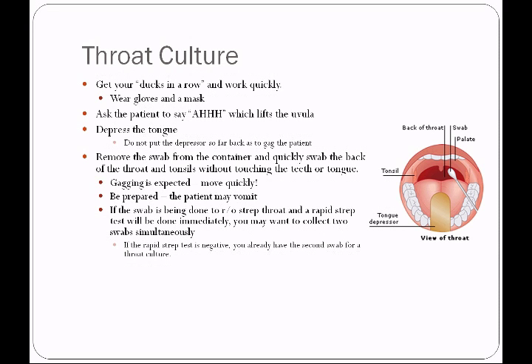That's beneficial because if the rapid strep test is negative, oftentimes the doctor will want the specimen sent to the hospital laboratory for a culture. So if the test is negative, you already have the second swab for a throat culture, and you don't have to go back into that little kid who has the sore throat who wants to bite you when you take a throat culture.